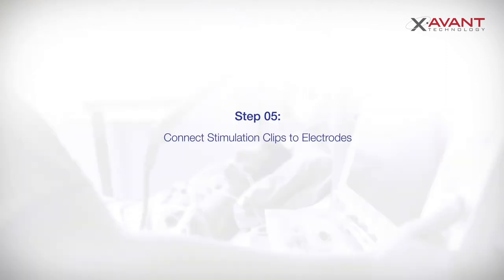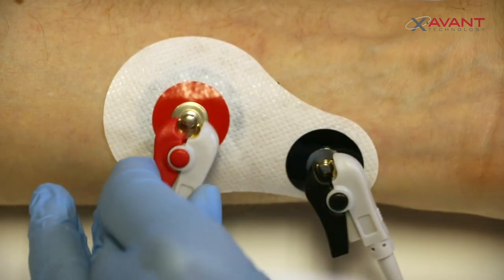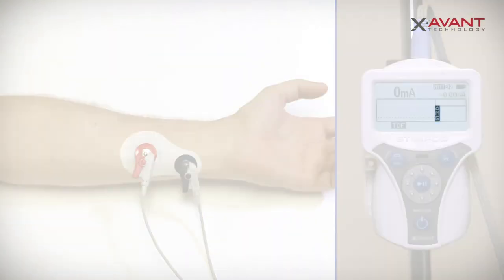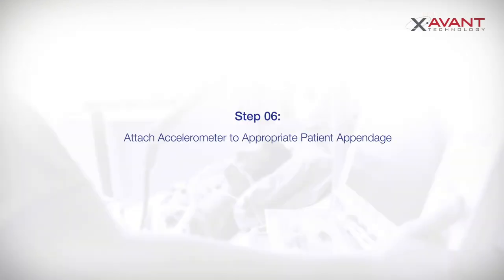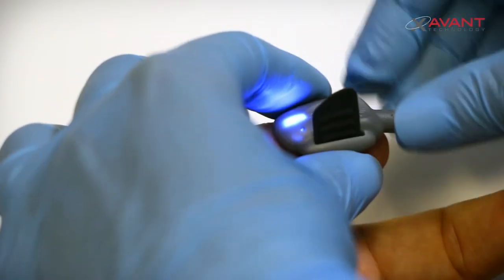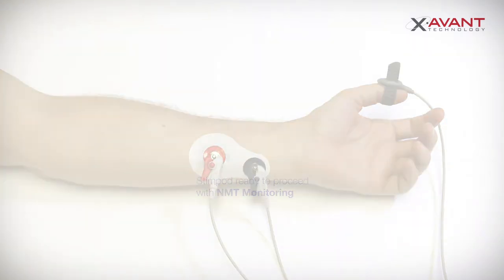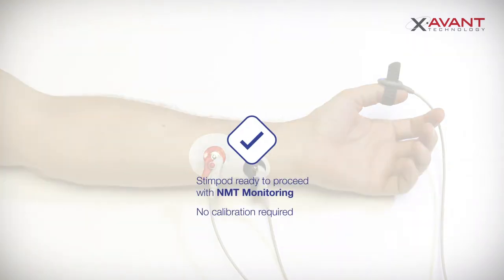Now secure the stimulation clips to the electrodes, ensuring that you have a proper connection onto the electrode studs. An AMG indicator will appear on the Stimpod. Attach the accelerometer to the thumb, ensuring that the thumb still has free movement and is not interfered with by the cable end or the strap. Note that due to the three-dimensional technology in the Stimpod, there is no need for calibration.